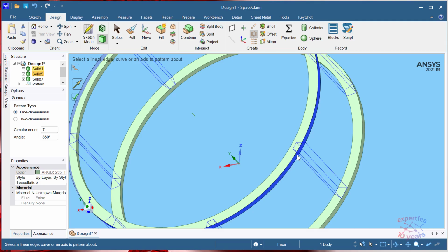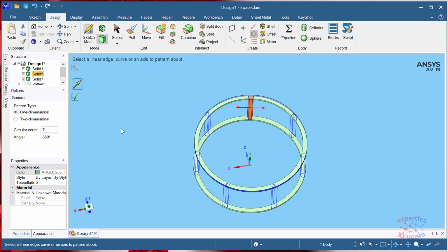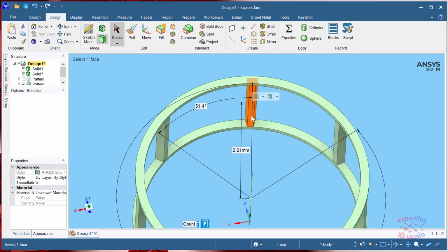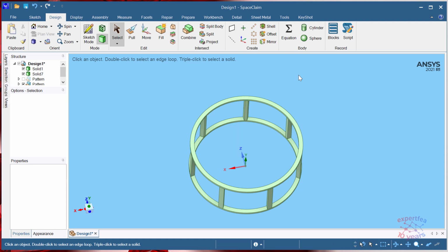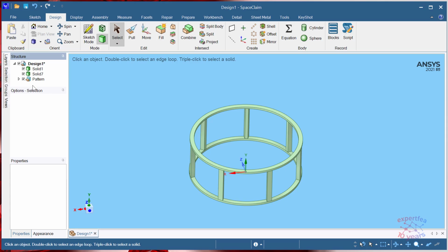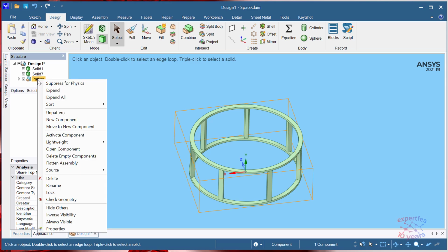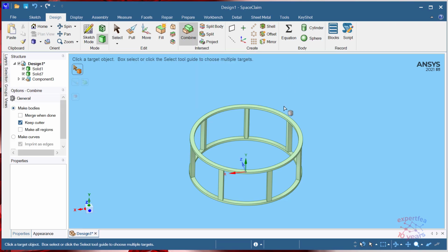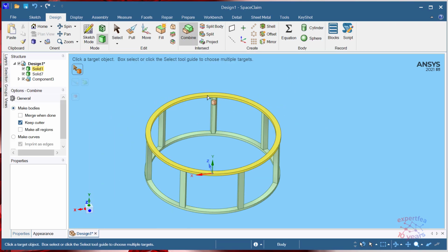Let's select this face, and it remained with 7 instances, everything. Only these are, yeah, separate bodies. Let's delete the original parallelepipeds, and here I will unpattern, because the internal pattern relations are not useful for the moment. What I would like to do is to unite all of these bodies, yes.